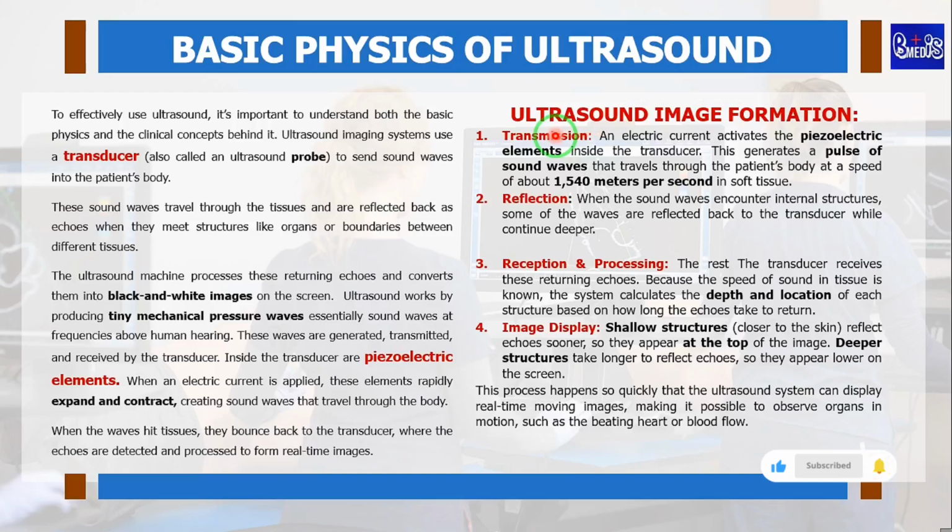The first step is transmission. Here, an electric current activates the piezoelectric element inside the transducer. This generates a pulse of sound wave that travels through the patient's body at a speed of about 1,540 meters per second in soft tissues.